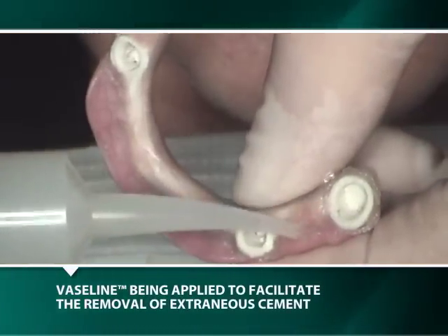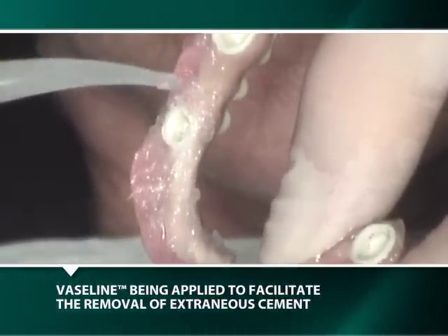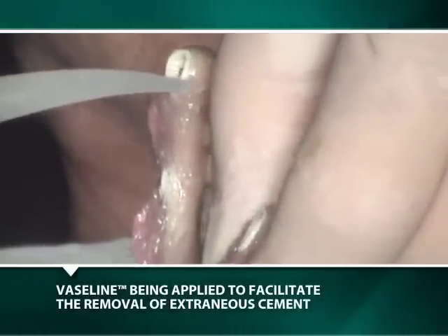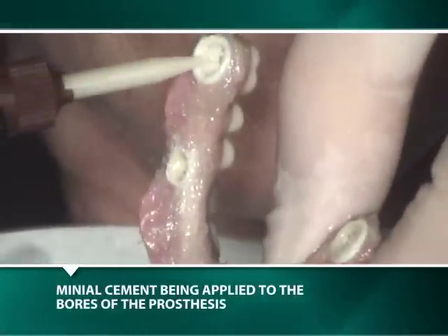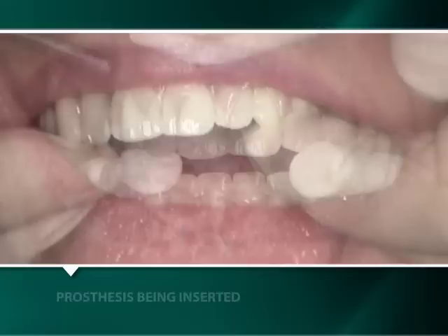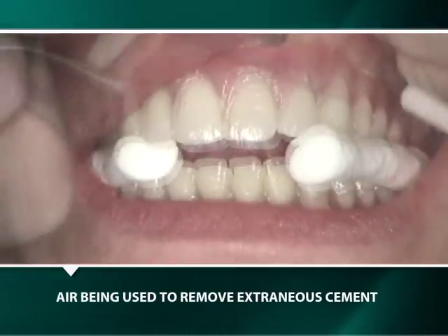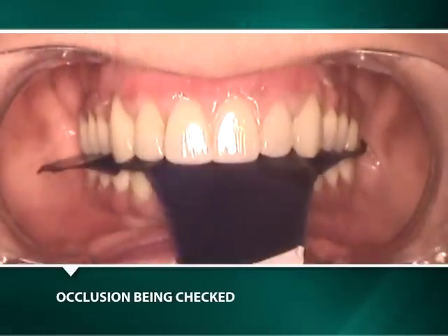Final or temporary cementation is achieved by first applying Vaseline over the ridge area of the prosthesis to facilitate the removal of any extraneous cement. Only minimal cement is applied to the bores in the TRINIA prosthesis prior to inserting the prosthesis in the mouth. The extraneous cement is simply blown away with the application of air under the prosthesis. The occlusion is evaluated and adjusted if necessary.